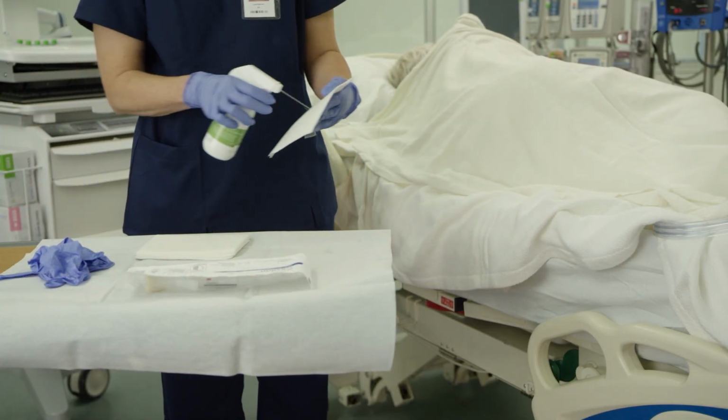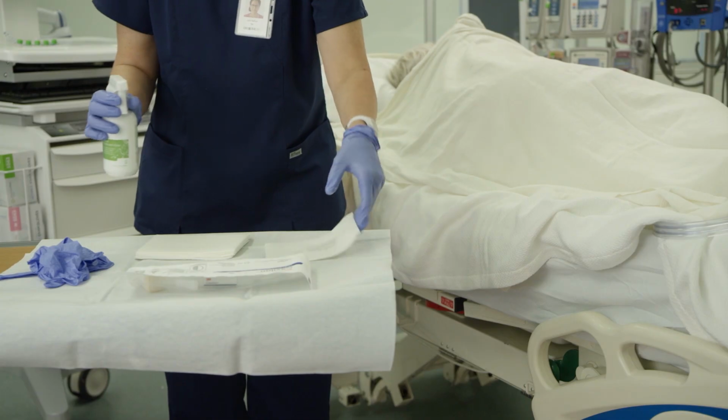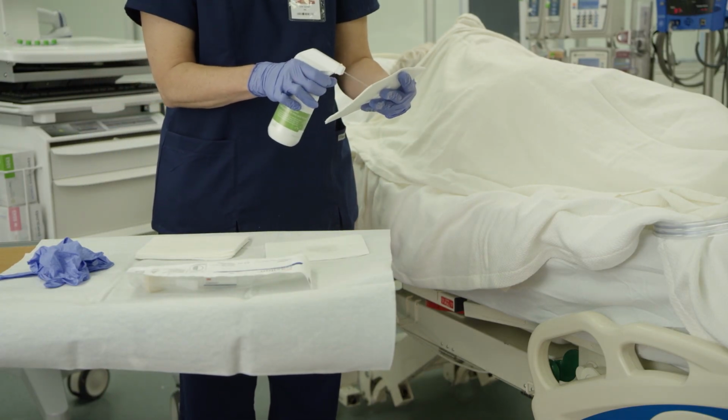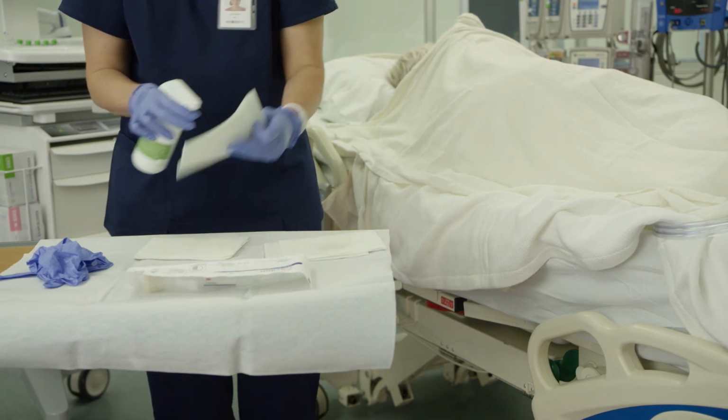Pre-moisten several wipes with the cleanser so you don't have to touch the bottle once your gloves become soiled. Alternatively, if you are using a bathing and cleansing wipe, you can remove several wipes from the package.